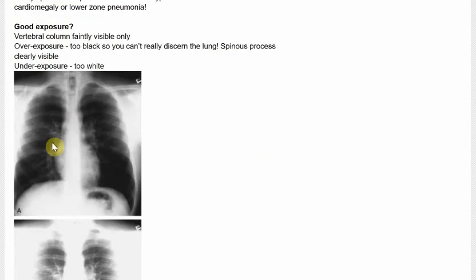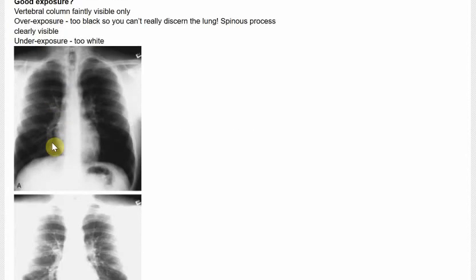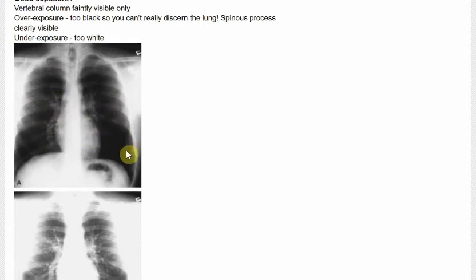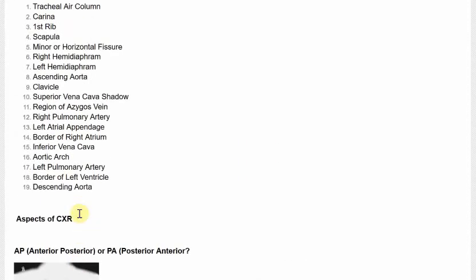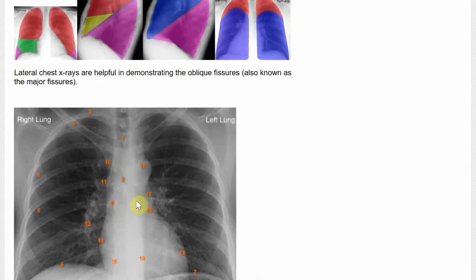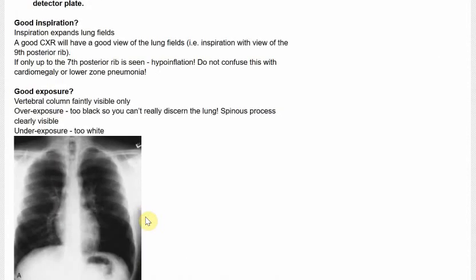Exposure is also important. Overexposure means everything's too black, and underexposure means everything's too white. Adequate exposure is where the vertebral column is faintly visible, as you can see here — everything's not too black, everything's not too white; everything's equal.